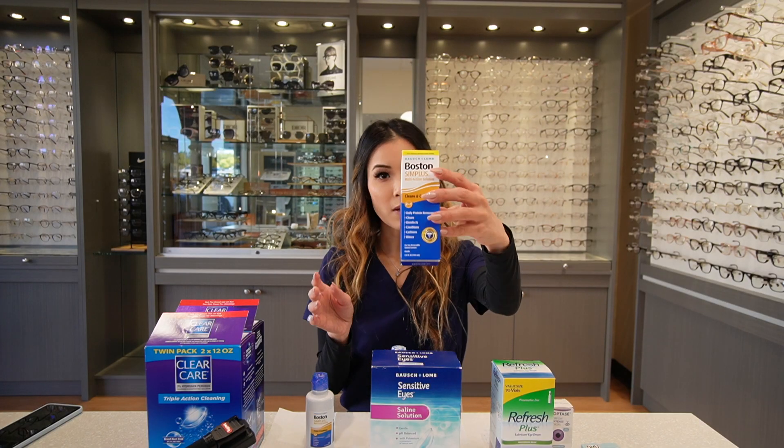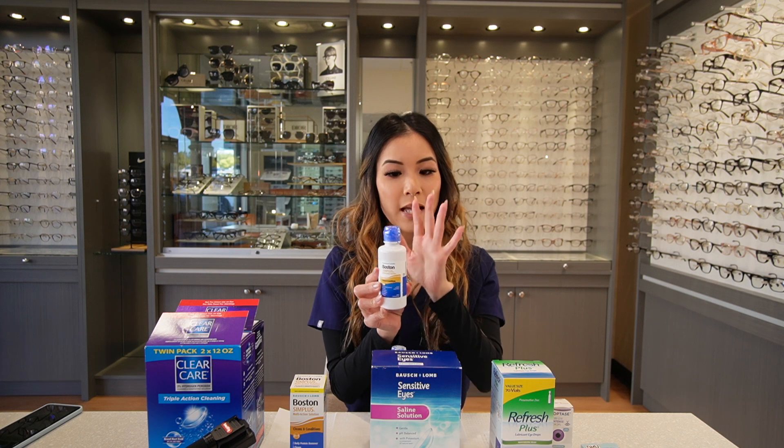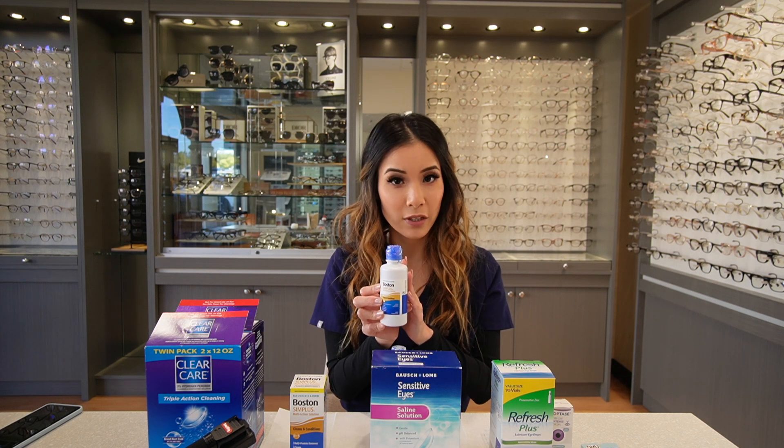The second bottle is Boston Sim Plus. This bottle is used to disinfect your lenses. Notice the cap is blue — be sure to use the one that has a blue cap and not red or brown colored.